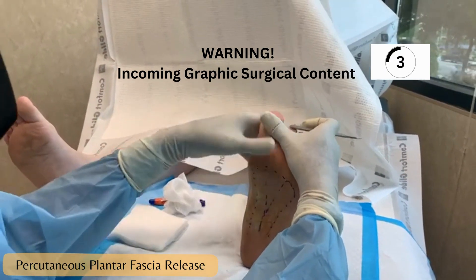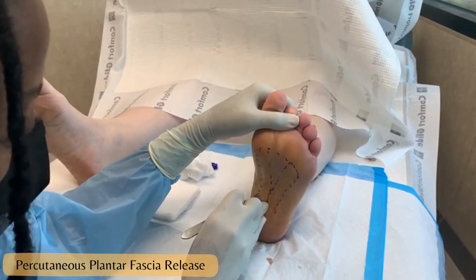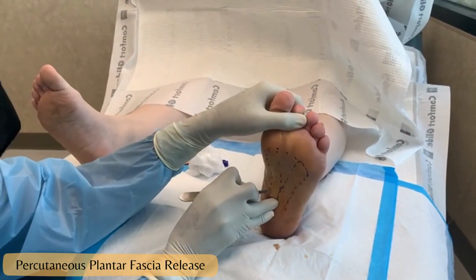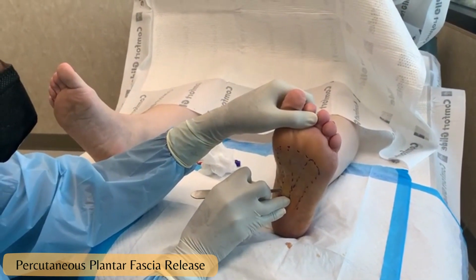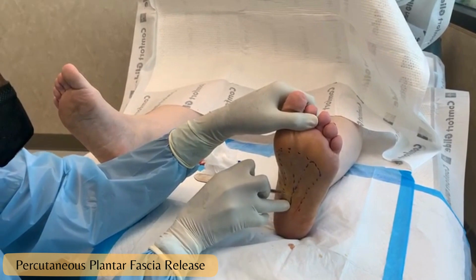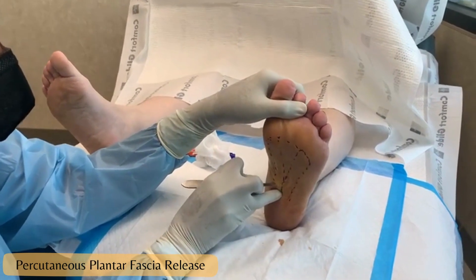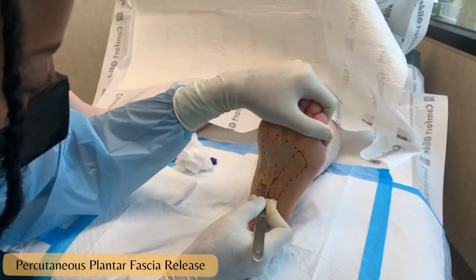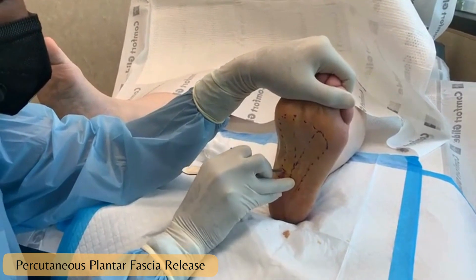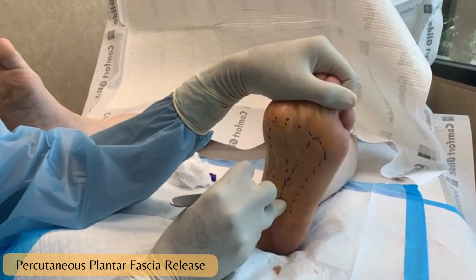We'll get a good release. What we're doing now — I'm just going through the fibers. If you are close enough, you can sometimes hear the fibers releasing. It's quite a tight band.